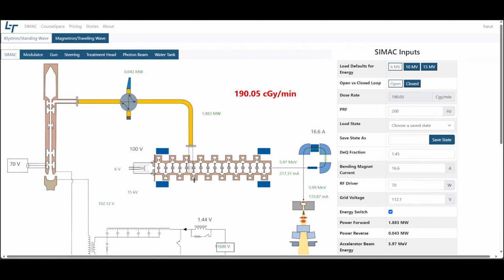This time we will explore beam steering, and how steering magnets are used to precisely control and direct the radiation beam. We use beam steering to ensure our beam profiles are symmetric. It's important to have symmetric beams, to ensure the dose delivered will match the predicted dose in the treatment plan, which assumes a symmetric beam.